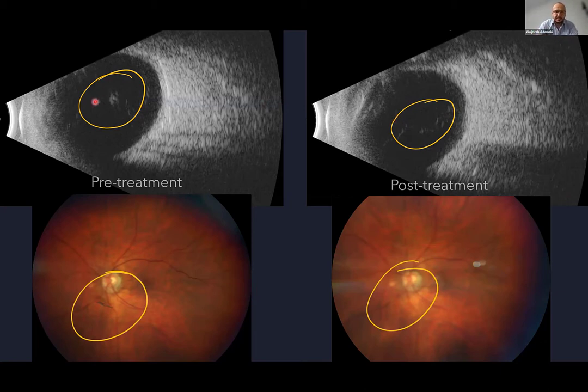Even though there's no Weiss ring that's been present before, I can still see some floaters. I'm still not satisfied with what you did. And we cannot really tell the patient anything because he's right? There are some floaters seen in this ultrasound. So in terms of documentation, I don't think that's a good option for our practice.